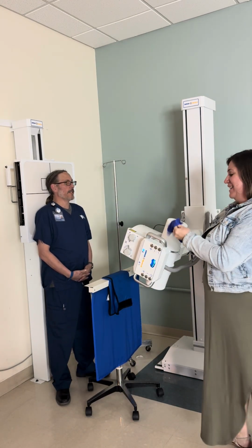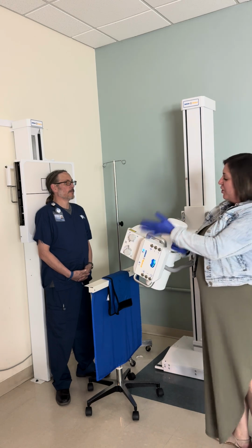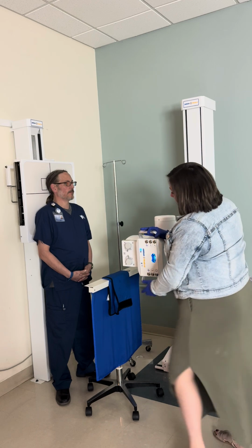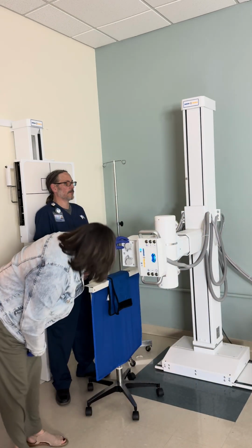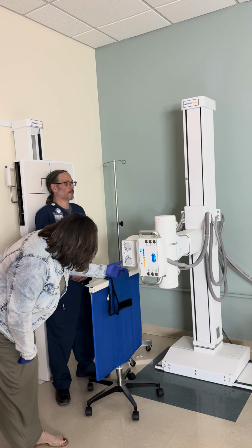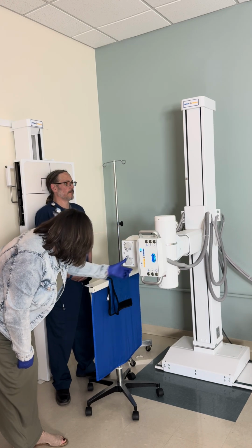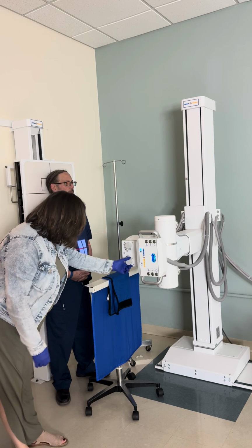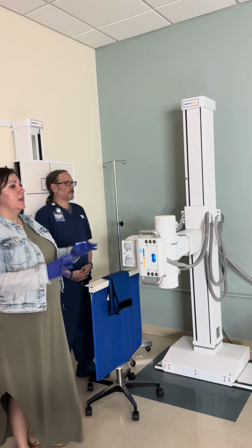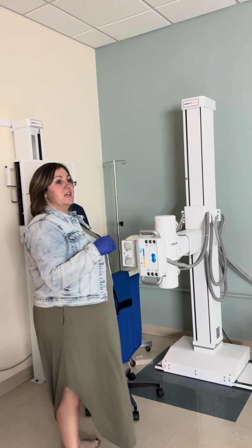No potatoes growing. So, I'm gonna take my angle off here, and I'm gonna go ahead and set my collimation to be about 7 side to side and 5 top to bottom. This is just so that I'm already kind of shrunk down so that I'm not blinding him when I go up to his face, okay?